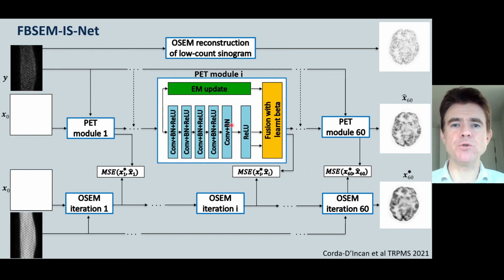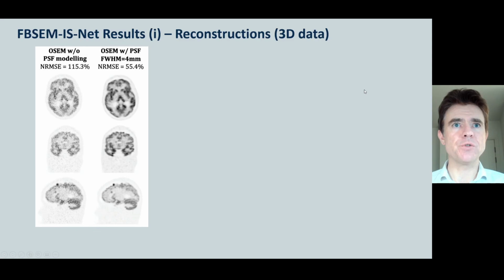networks. And what that will do really is stop the method from learning to do all the hard work at the last module, which is in fact what can happen. Whereas here, this imposes the requirement that we expect a nice gentle progression towards the high quality final endpoint image. And so this was a method published in 2021. These are the results with the method.